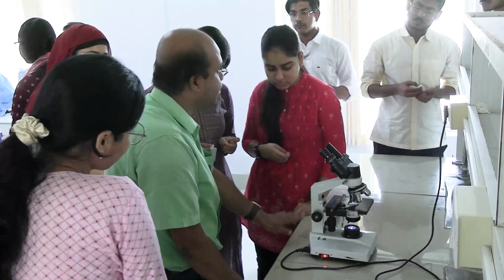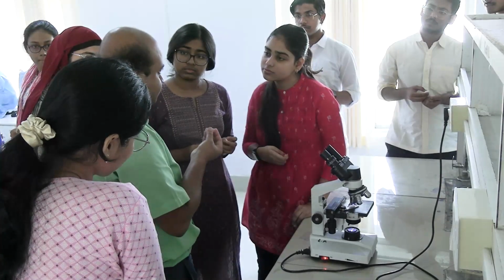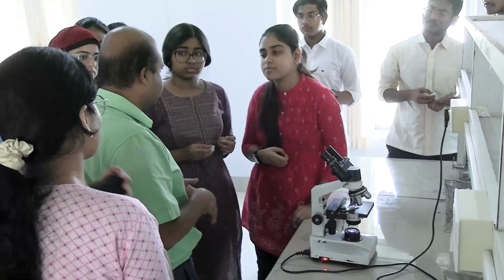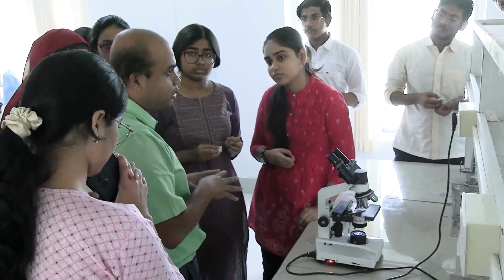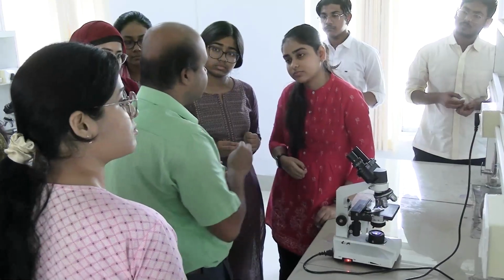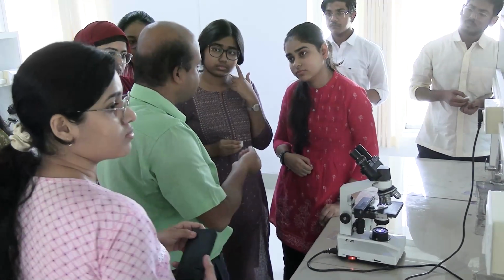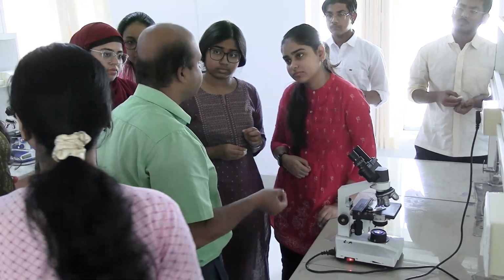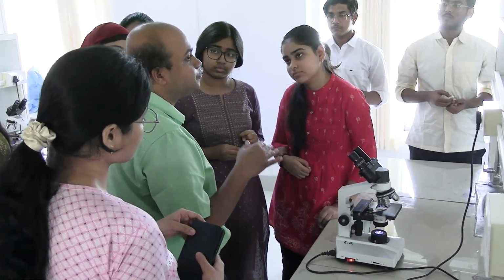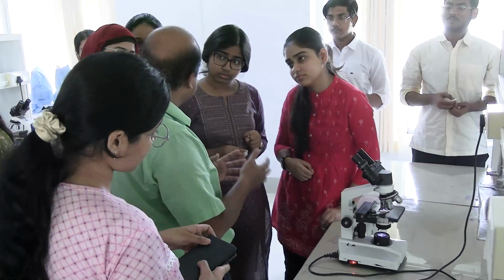Even if you take 1 or 2 drops of blood, it should be fully blood. If it is mixed with spirit, the cell counts will lessen. Blood diluted with any other fluid will not give good results. Another thing is that drying takes some time, it may be 30 seconds, 45 seconds, 1 minute. That time is required for the disinfection action to occur.